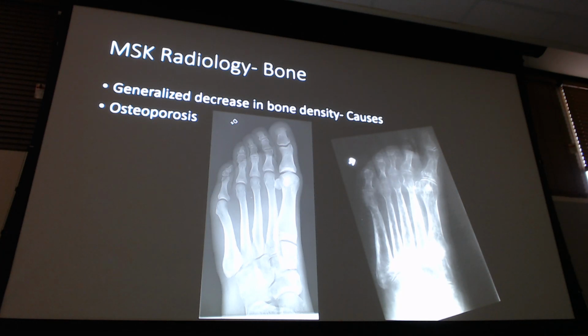So does everybody see how much more radiolucent that medullary canal is, the trabecular pattern, whatever words you want to use for this course, compared to one another? Okay? This here is just dealing with technique. This bright white down here, this is not anything. This is not like an osteopetrosis starting or anything. It's just osteoporosis throughout all of those bones. You see that?